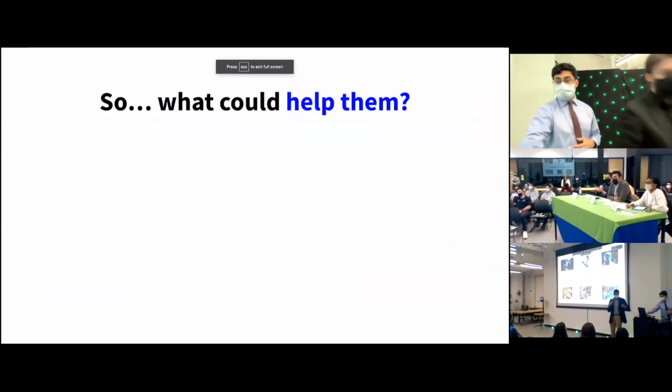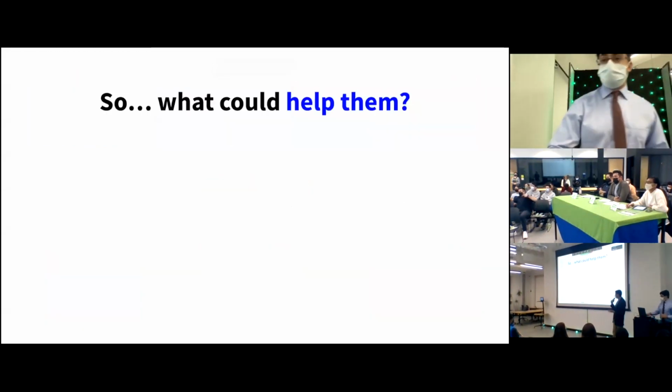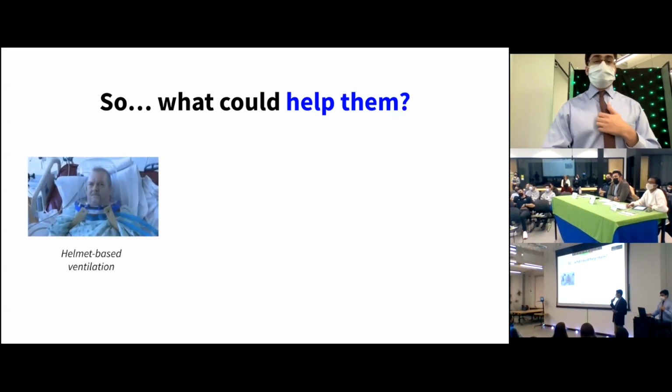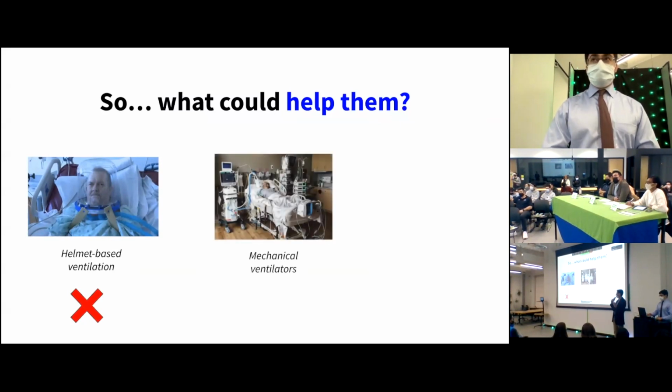We're back in business. So yeah, when these people need breathing treatment, they need options. What options do they have? Well, there's three of them. First is what's known as helmet-based ventilation. This is essentially when you look like Sandy from SpongeBob and have a giant helmet placed on your neck in order to get breathing support. It might work, but it's hugely alienating and hugely isolated, which we think is a harm for patient comfort.